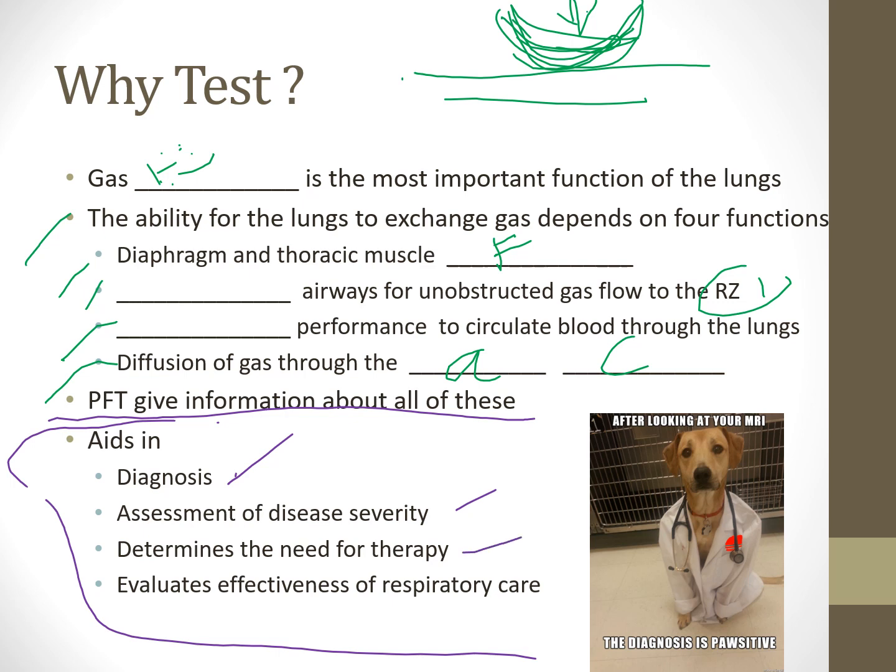If we have someone who has issues breathing when they're working out and they have a possibility of exercise-induced bronchospasm, or if we have someone that just has very reactive airways, then we can do a pulmonary function test, have them blow into a device, give them a breathing treatment, and then have them repeat that same measurement.